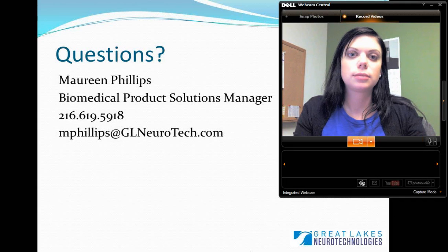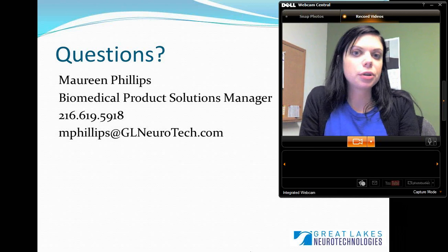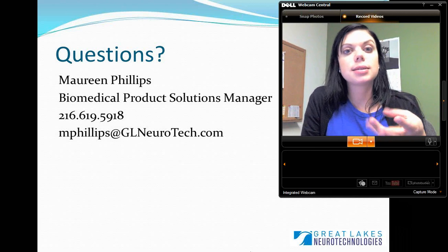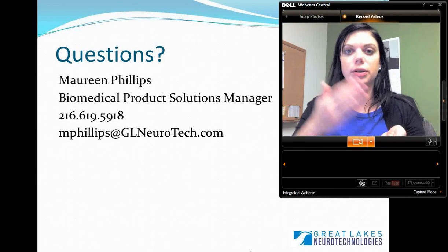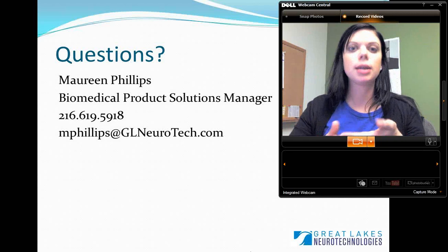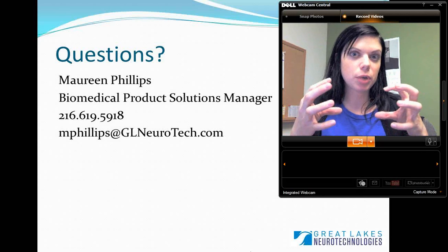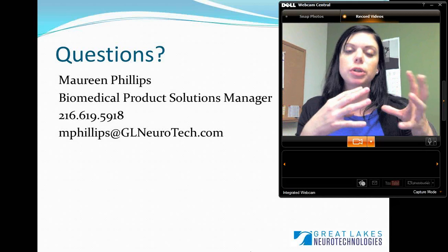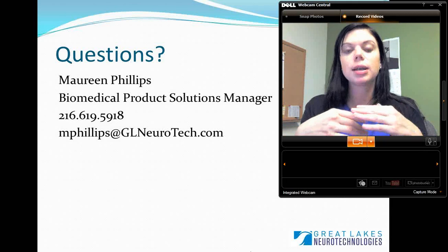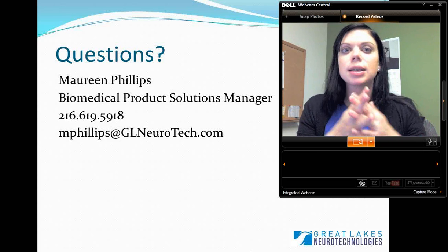Is coherence analysis possible with your software? It depends on whether or not you're looking for automated analysis, where you might just go through and say, here's a level of coherence A, here's a level of coherence B. What you would really need to do is define the parameters of coherence. How are we determining whether somebody is coherent or not? Is it an indication of alpha wave occurrence? Is it delta wave occurrence?